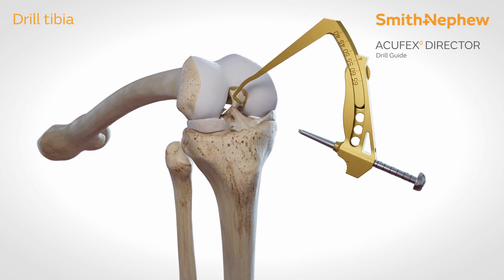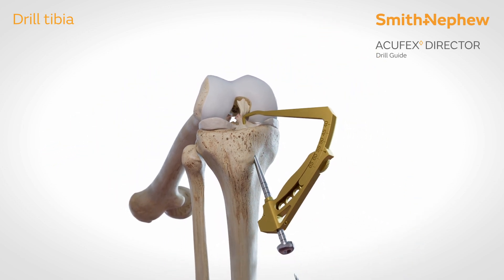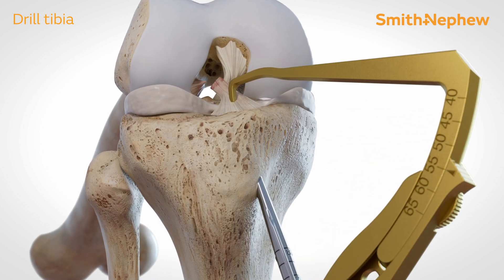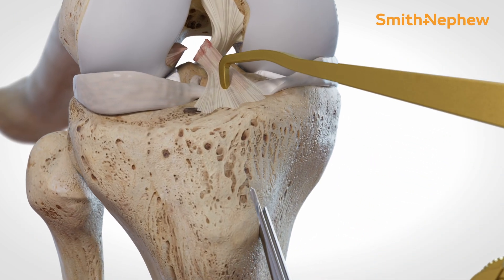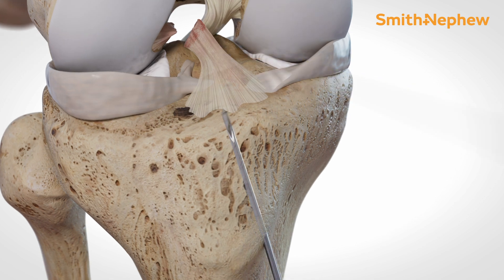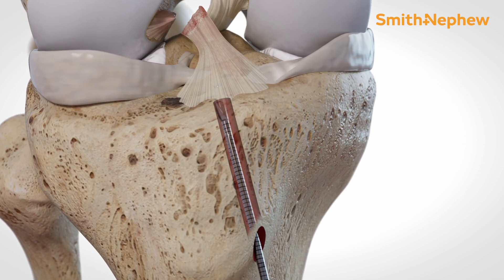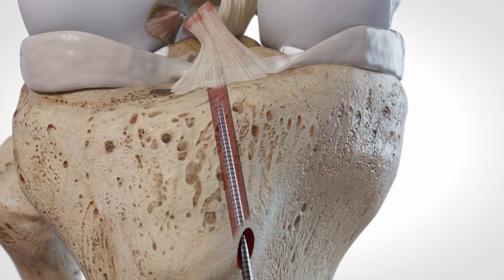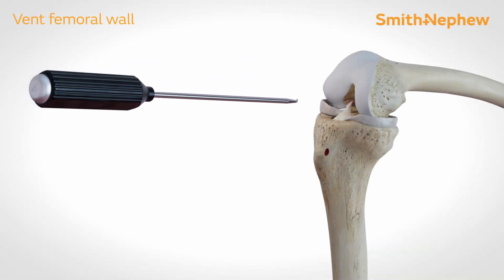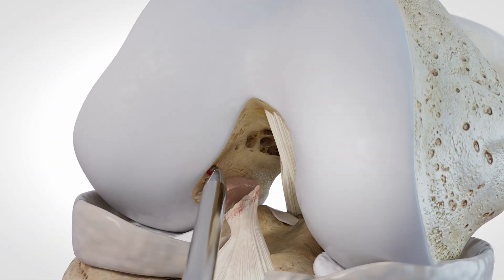Place the tip of the Acufex Director guide tip aimer in the centre of the tibial footprint. Place a 2.4 mm guide wire through the director guide so the tip breaches the cortex and exits the centre of the tibial footprint. Drill over the guide wire with a 4.5 mm endo button drill bit, careful to just breach the cortical tibial bone. Use an awl to vent the lateral femoral wall, careful not to disturb the articular cartilage or the femoral footprint.